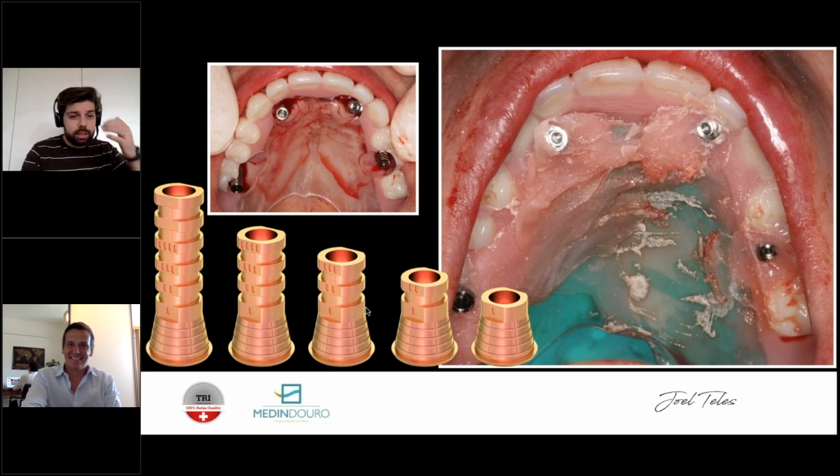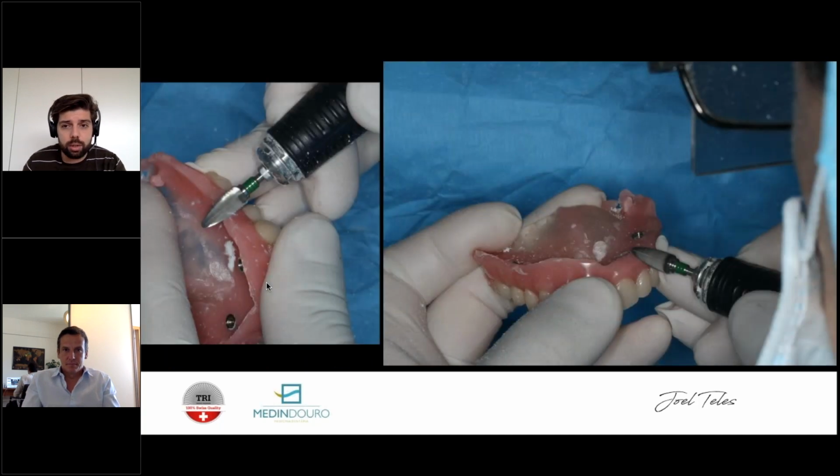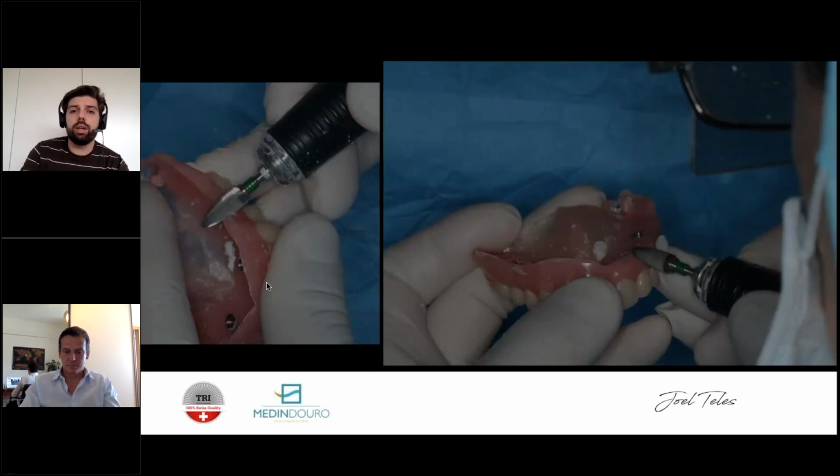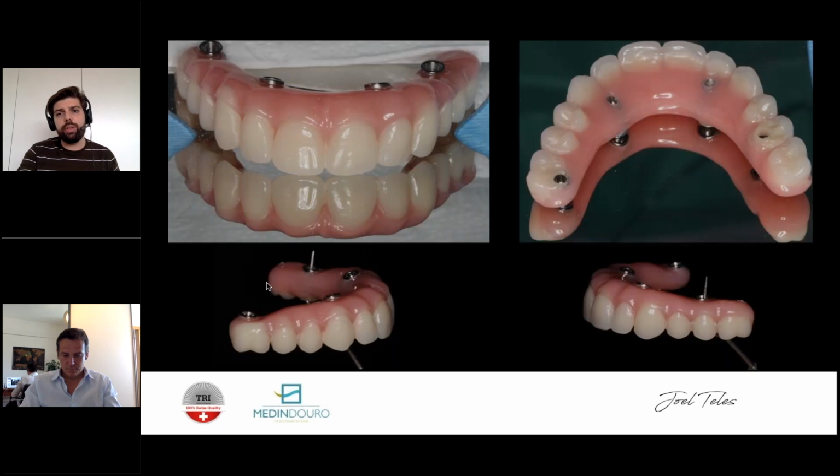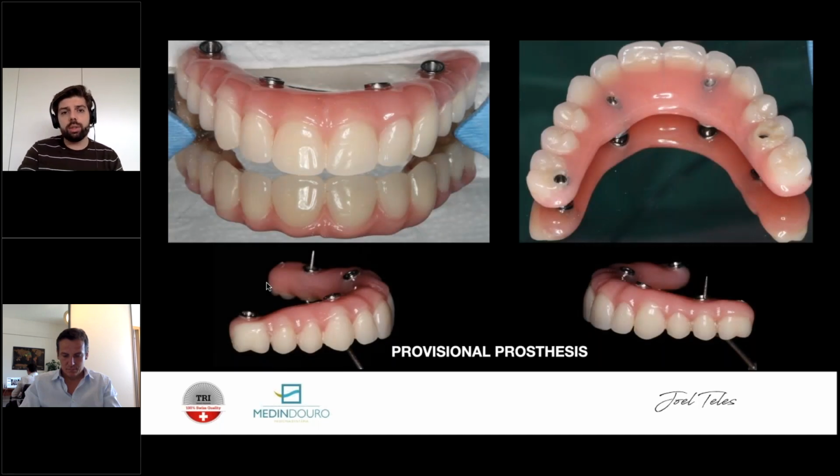Okay, let's go into the prosthetic part. So this is the tie base, the TTAs that you have, and they work for this provisional part. Always in this part, my technician does the work. He knows exactly all the principles that we've discussed over the years, and he knows exactly how to transform these prostheses into a fixed provisional restoration. So we will reshape everything, he will cover everything, and end up with these results, where you can see that it's very easy to floss here. There's no concavity, it's all very convex, it's very easy to clean, and it has to be exactly like this.